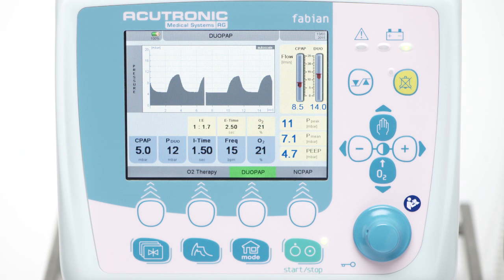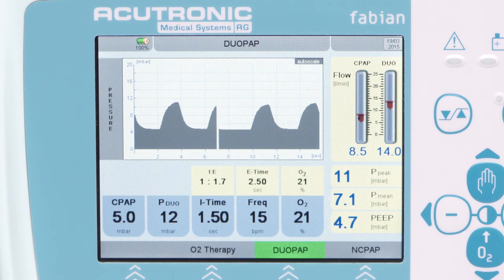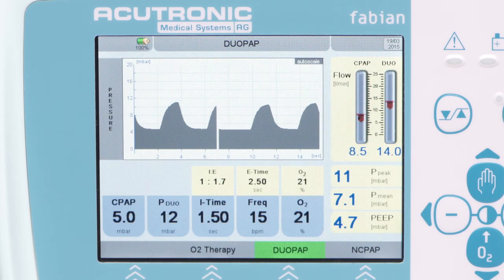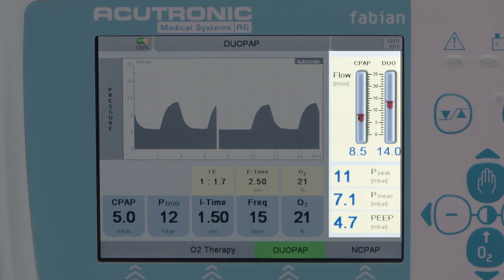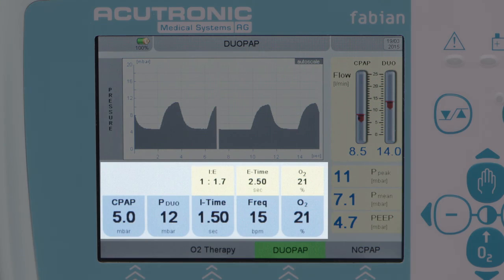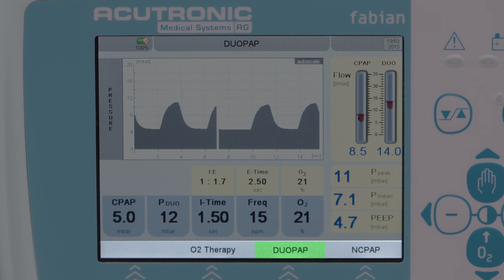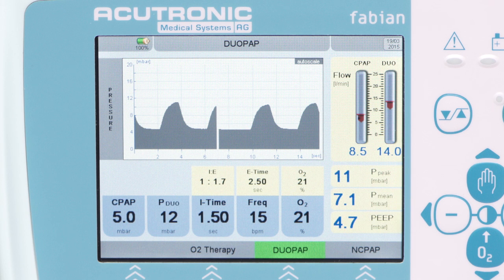The screen shows various information, setting and display fields depending on the display settings or menu. The screen is divided into five zones: 1. Infobar indicating battery status, time, date, status information, system and alarm information, and ventilation mode. 2. Pressure graph. 3. Parameter setting field. 4. Selection or display of operating mode. 5. Numeric field and alarm limits.